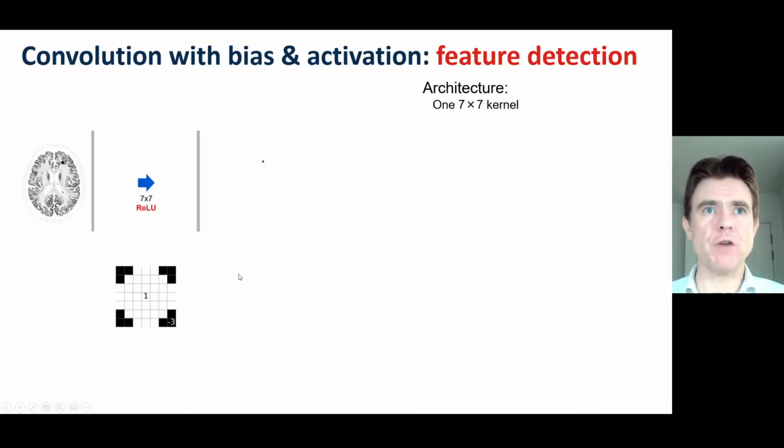So if we do that ReLU, that rectified linear unit, set negatives to 0 after a given bias has been chosen, what we end up with is a nice feature map that only identifies that feature of interest, which for example is this lesion as indicated by our chosen filter in this example of how to do feature detection. So therefore you can see it's nicely picked out, that feature as emphasized in that red circle.